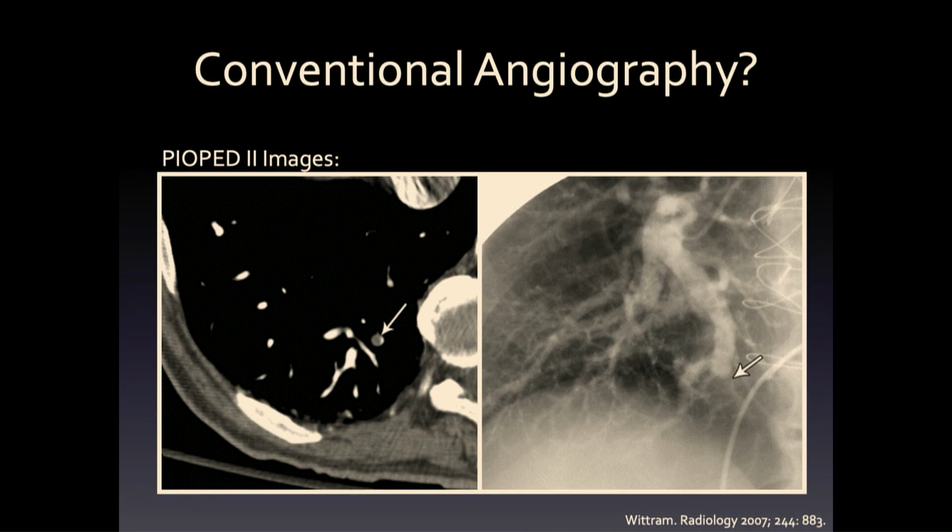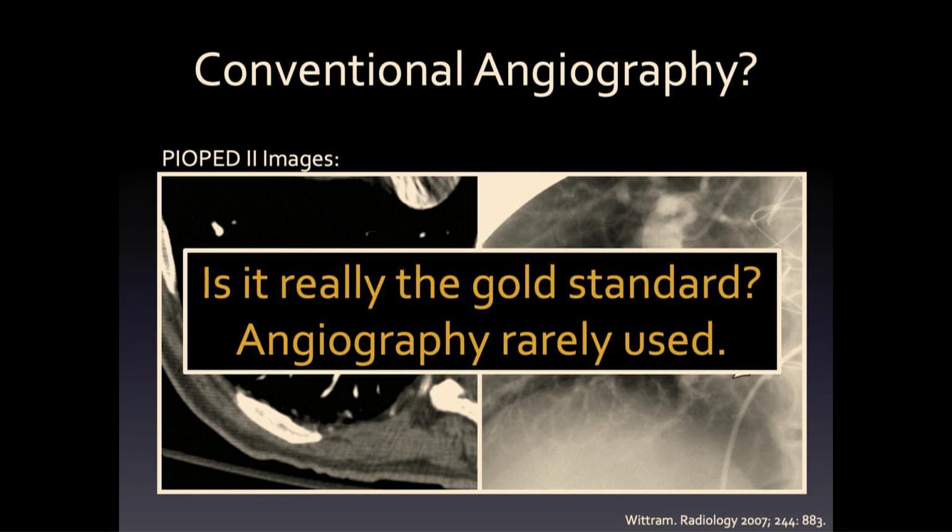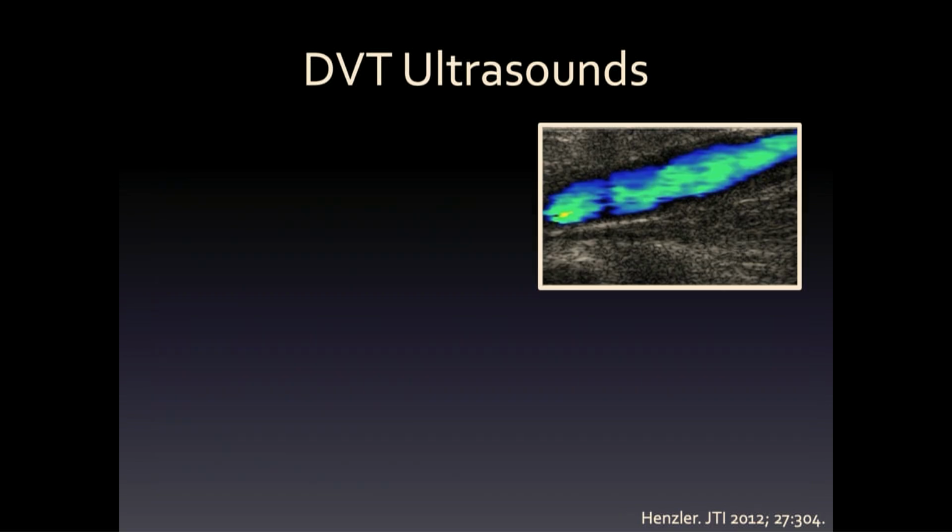I actually think, professionally growing up in the CT era, that's a very hard thing to read, a three-dimensional lung smushed into two dimensions. Is it really the gold standard? Probably not, given how invasive it is, and obviously not used much.